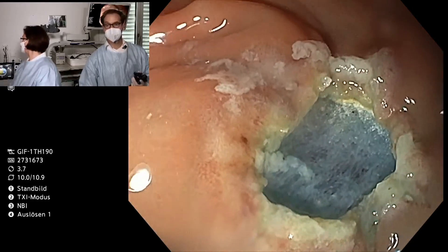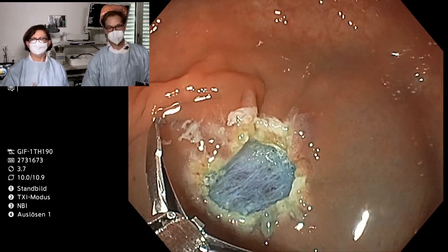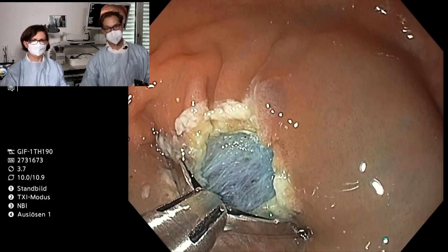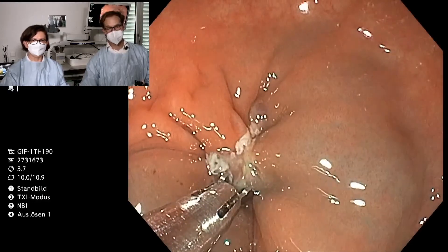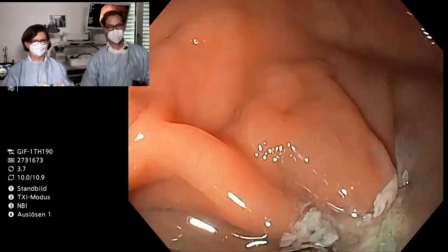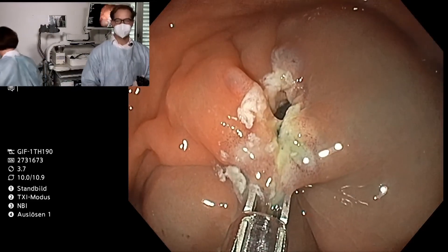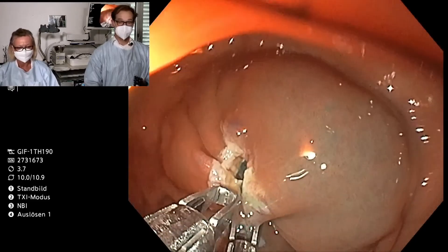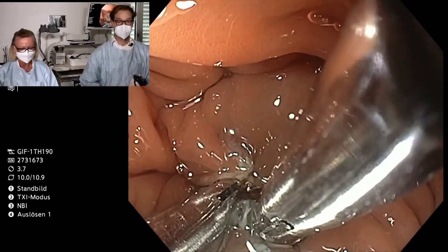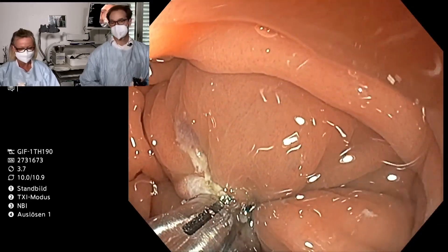We are taking the Cook Instinct clip. I open the clip and try to place it over the resection area, grasping a bit more tissue. You see the Instinct clip which has a very large diameter. I close it, hold on for a second, and confirm it was successful. Next clip please — placing the second one just above. Now it is closed, and by pulling I can see if I grabbed enough tissue. It looks fine, so I completely close the clip.